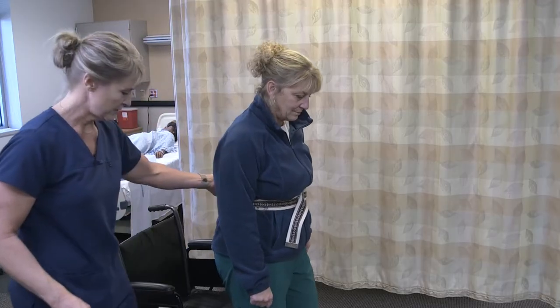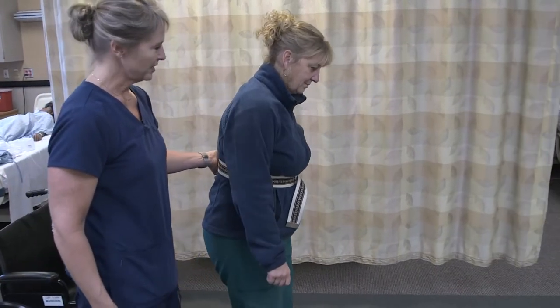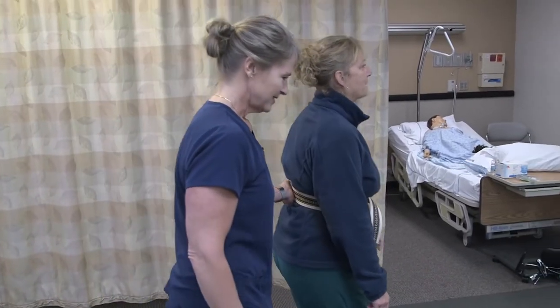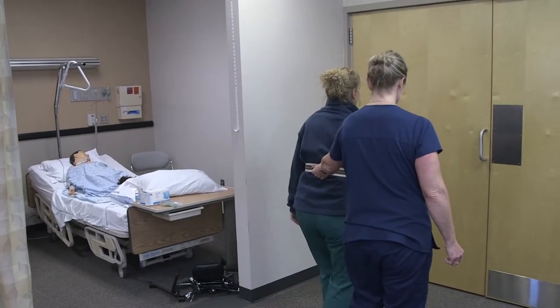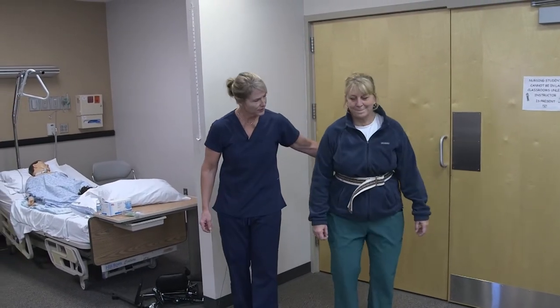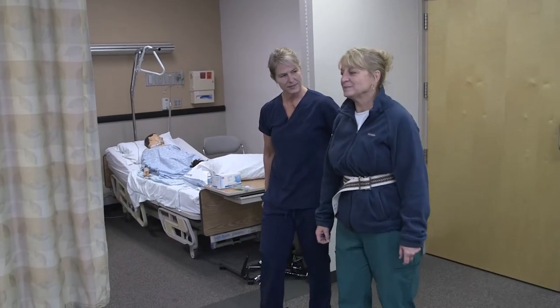Annie doesn't use a cane, so we're going to start walking. Try to keep your head up and pick your feet up as much as you can. We'll just go to the door and then we'll turn around. Doing okay? Keep your head up, keep your feet up.